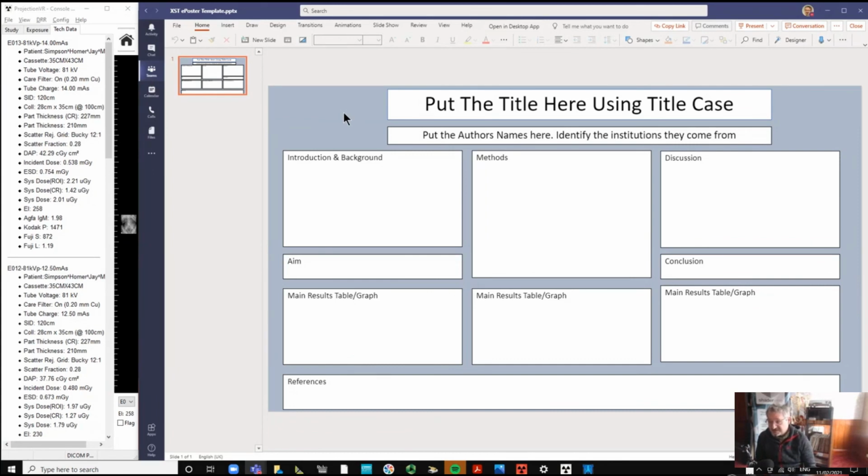And we've spent 45 minutes today doing the experiment and collecting the data. So it wasn't that complicated, really. It'd probably take another hour to do the image quality scores and collate all that data. So in 3 hours, you could have created the data set, then take a couple of days to write up the paper and submit it to a journal.